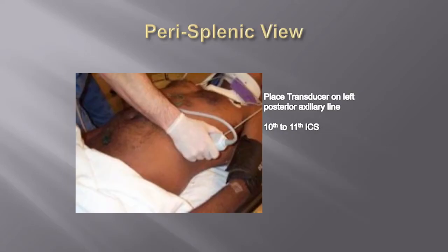So perisplenic view, hand over the patient. This guy is kind of out of position. So I would put this hand and touch the bed and then work your way up, and then you'll find your image better that way, all right?